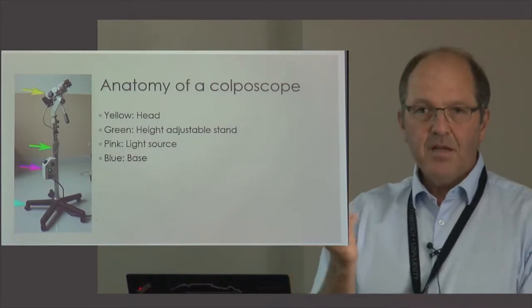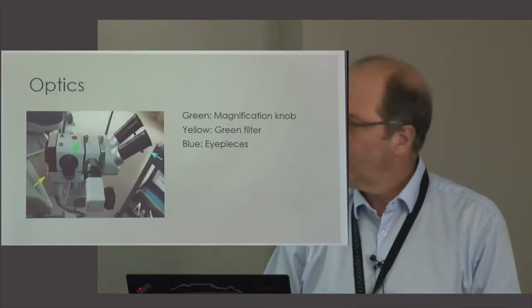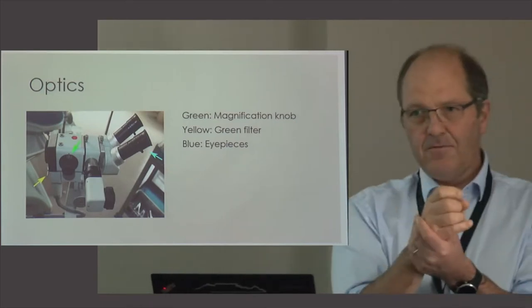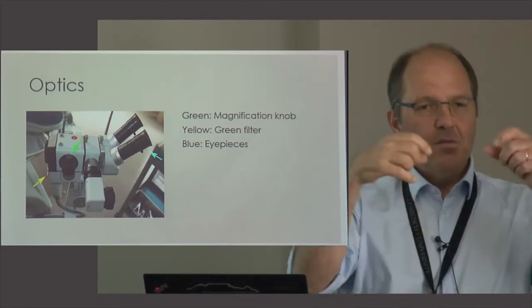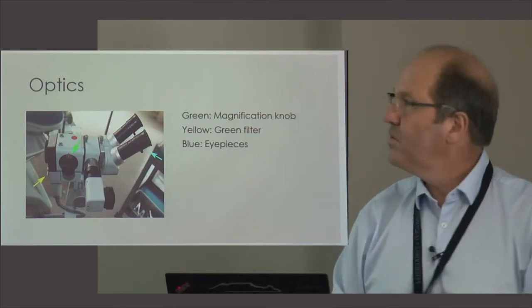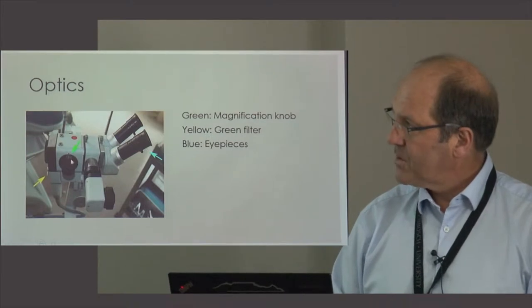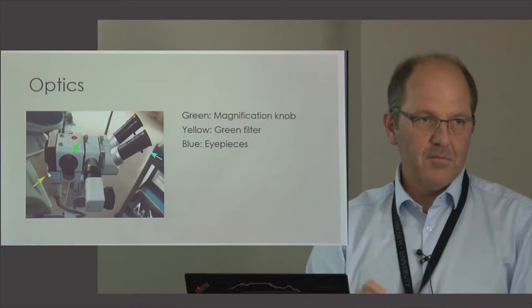At the pink arrow you see the light source — depending on the type, you may need to allow it to cool down before switching off if it's an old-fashioned bulb. The optics of a colposcope consist of a few components. At the eyepieces there's a diopter dial. Set it to zero at the beginning of the clinic, though if you have a special prescription you can adjust accordingly. There's also a magnification knob, ranging from about 4 to 60, and somewhere a green filter that you can engage to get a much better view of blood vessels.